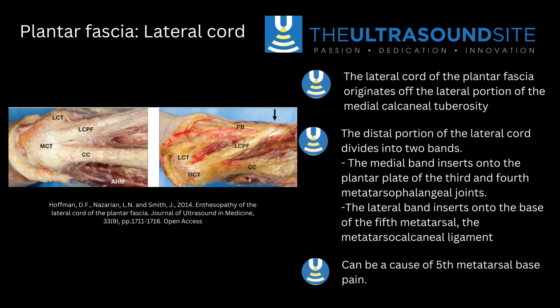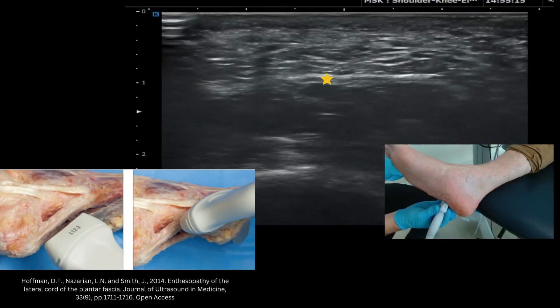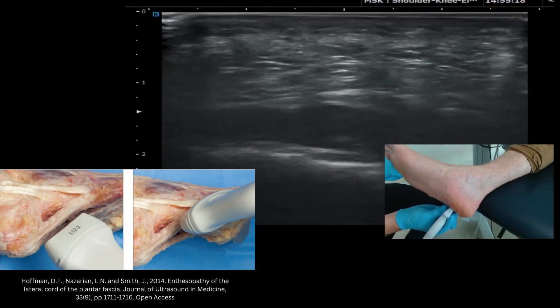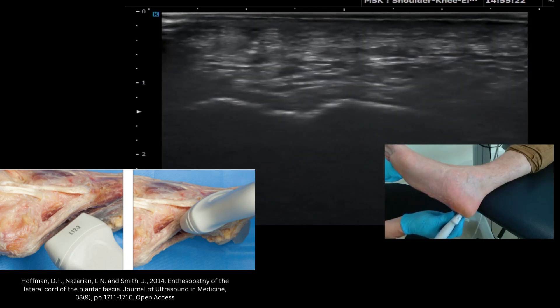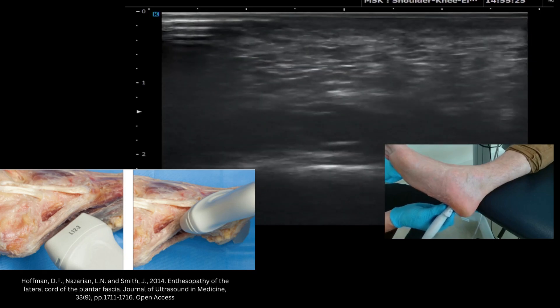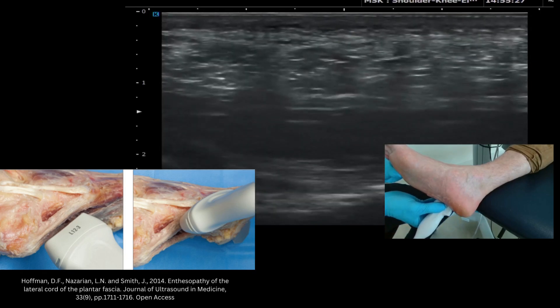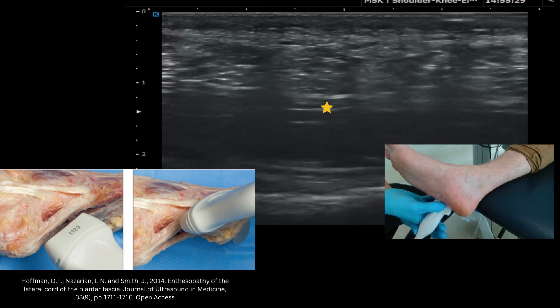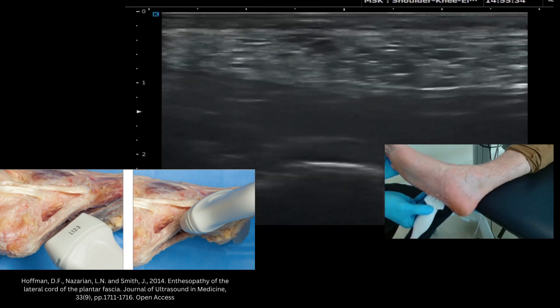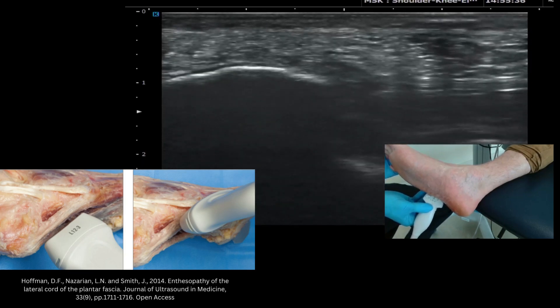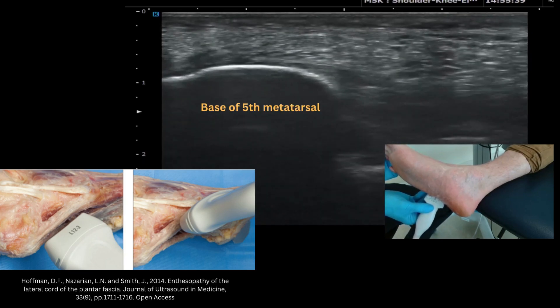You can see here on the slide the outline of the anatomy of this relevant area — it's an important structure to evaluate. Looking at the live scan, we can see in a short axis view the hyperechoic appearances of the lateral cord of the plantar fascia, and when you spin around into long axis it's a linear structure that tracks down over the lateral plantar aspect of the foot towards the base of the fifth metatarsal.